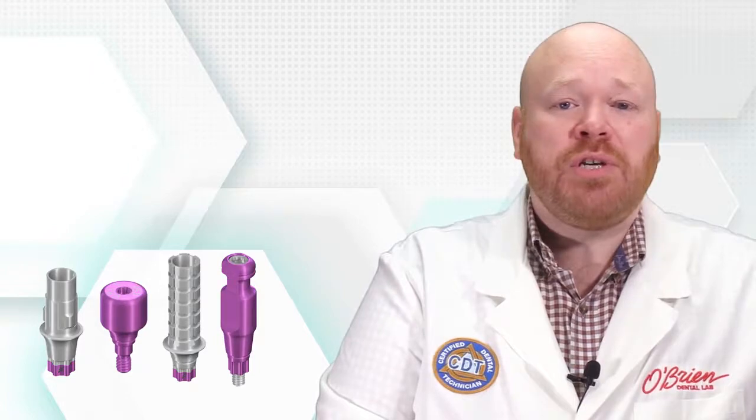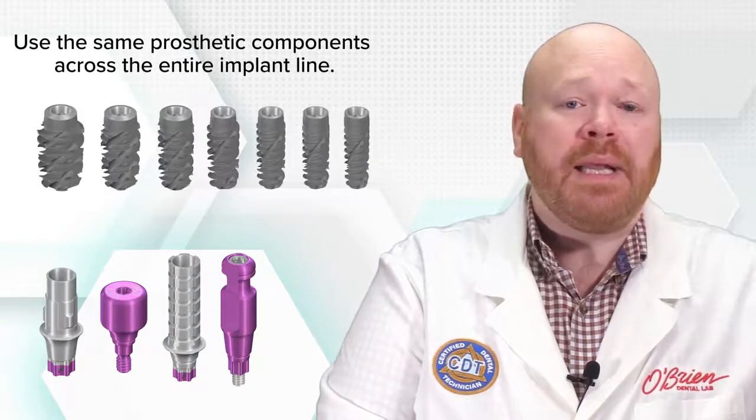The Stramon BLX implants all share the same prosthetic connection regardless of the size of the implant, and this allows you to use the same prosthetic components across the entire implant line.